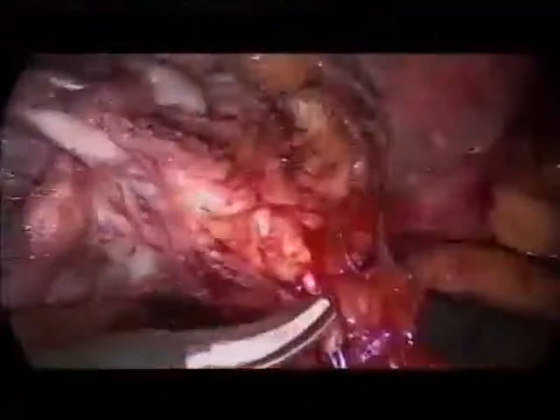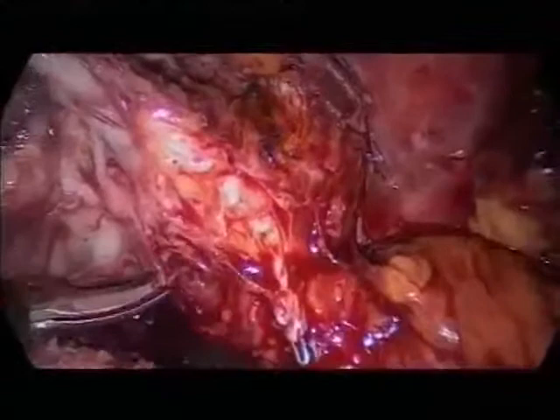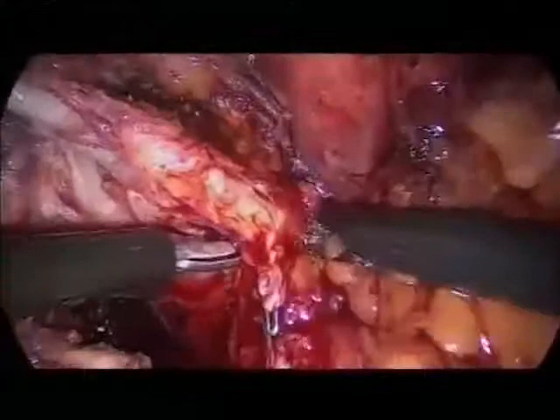On the other hand, when you're not sure with the plane, go back to this side, go back to this side, and then you have a feeling, okay, the bridge between is here. And now you see it's easy to cut.